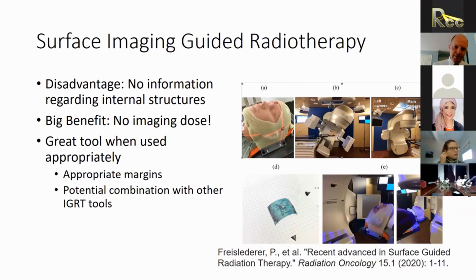It's not kV, it's not MV. In Elekta, it's called Catalyst. It's a way of IGRT. I don't know if Shaimat is from Egypt or from Alexandria, but if you are, it's here in Egypt. It's in two hospitals. If you want me to share it with you, I can send you more information in the groups also. So I think we finished.